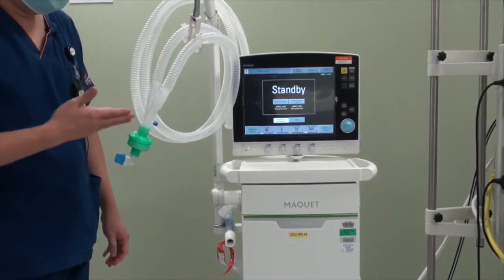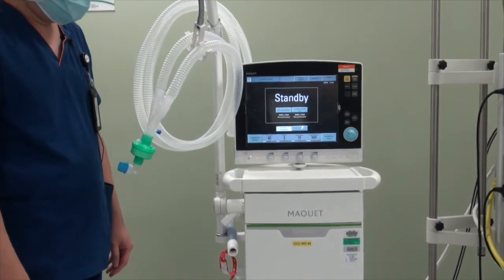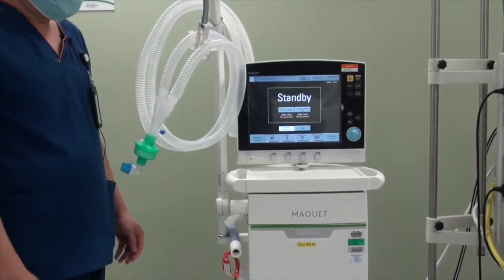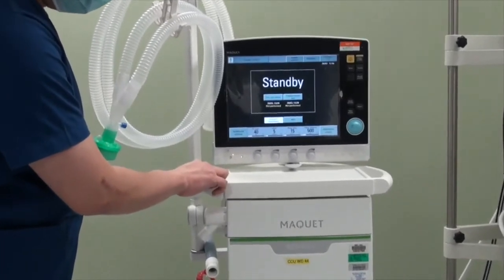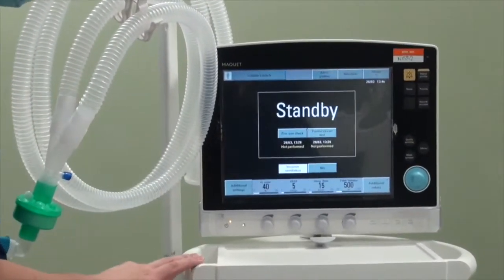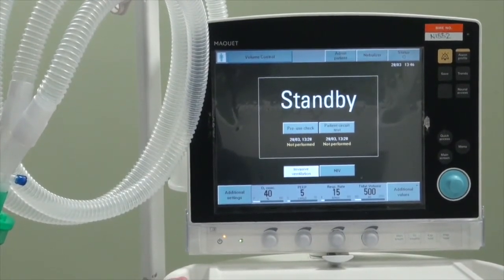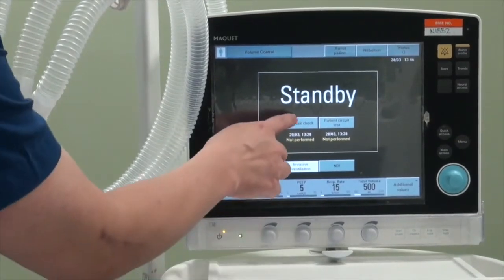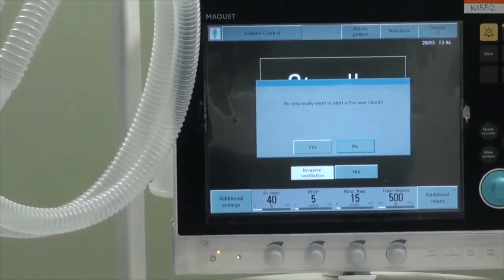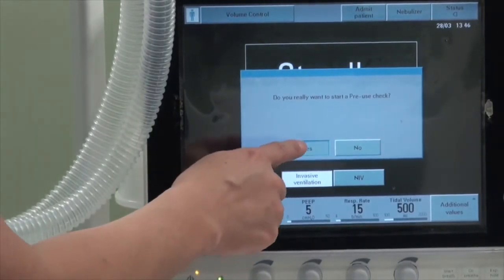Before we put the Servo-i on the patient, we need to do a pre-test. When you wake the ventilator up from standby mode, it will prompt you asking whether you want to do a pre-use check as well as a patient circuit test. We will start with the pre-use check — press the button to activate and confirm that you want to start.